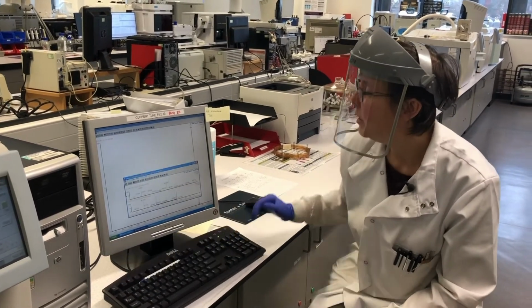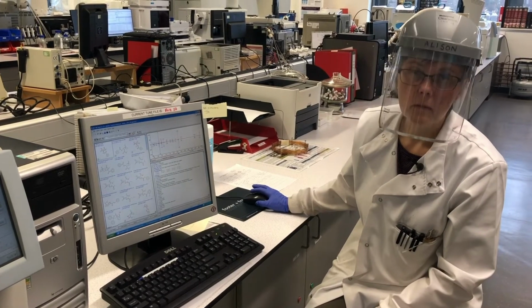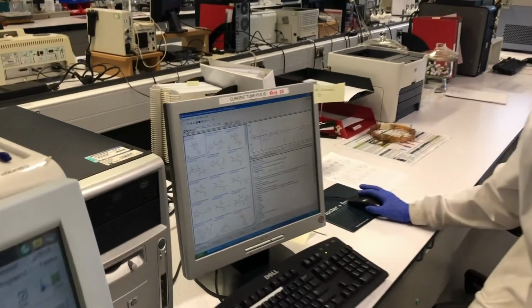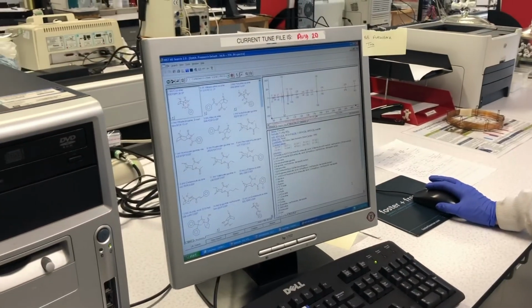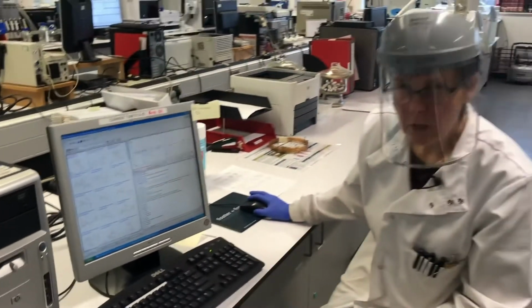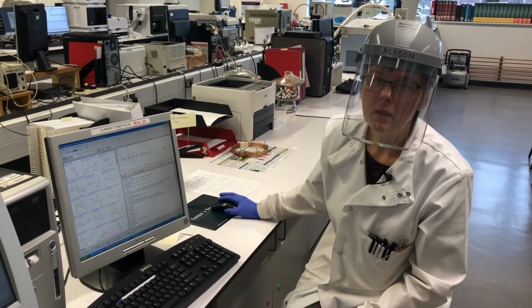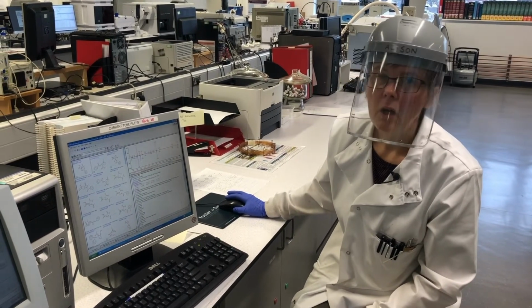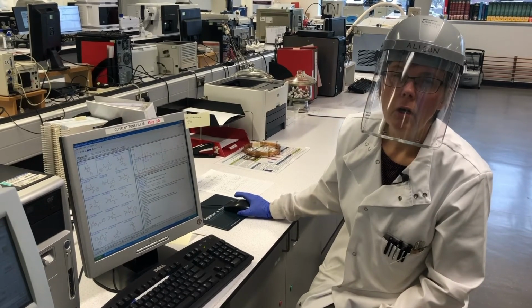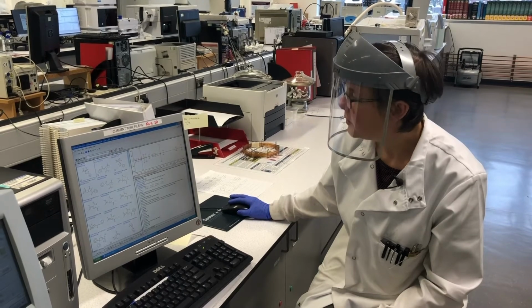Mass spectrum will come up and that's showing us cocaine. So that's a positive confirmation for the presence of cocaine in our sample. We may run a standard to ensure we have the same retention time, and that would be considered very convincing evidence and allow us to charge our suspect, at least with possession. Let's see what else we can find out about the sample.